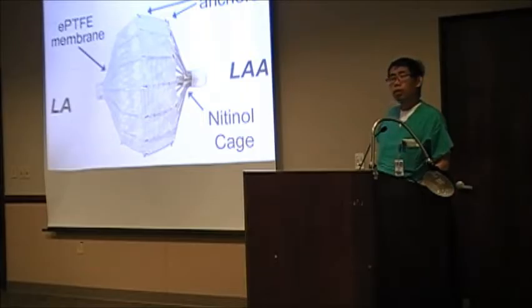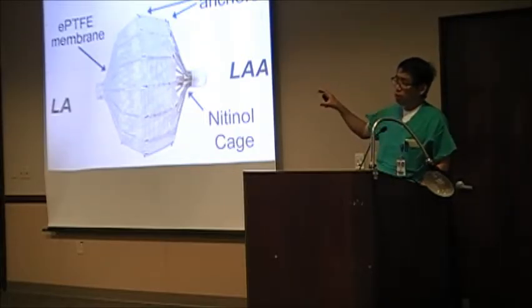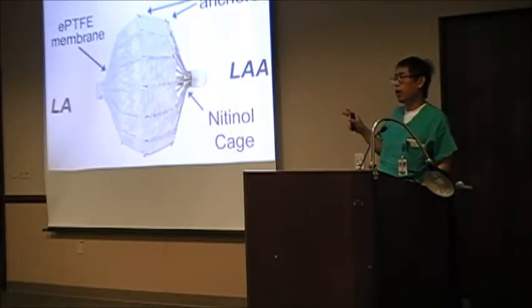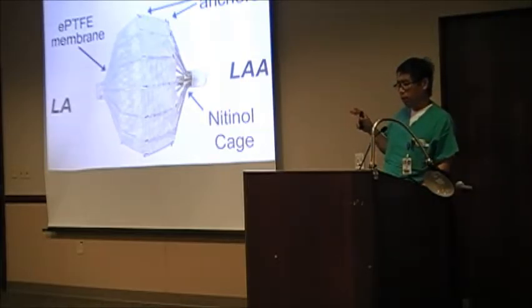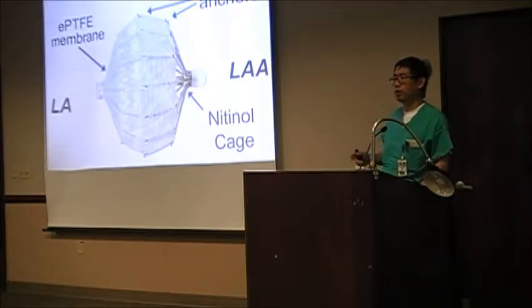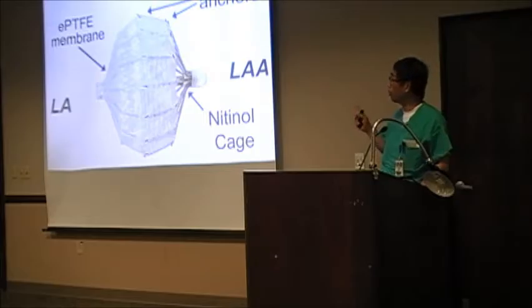Plateau is, how many years is this out for the market? That's going to be 4 or 5 years probably? At least 5 years, that's right. In the old time, they used something like a balloon: they deploy it inside and suck in the ostium of the appendage. But because the complication rate was so high and the company had no money to improve the device design, they totally withdrew from the market and nobody uses it. This was just the very beginning idea of closure devices, so I still show this.